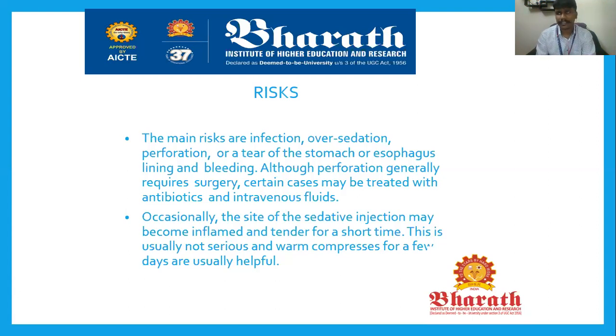While the endoscopy is being done, the patient can't bear the pain. They will feel a vomit sensation, so sedation will be given. Sometimes over sedation is given, which can also collapse the human body. Another risk is perforation of the tear of the stomach or esophagus, internal lining, or internal bleeding due to improper handling of the endoscopy, and internal injury can happen. That all comes under the risks.